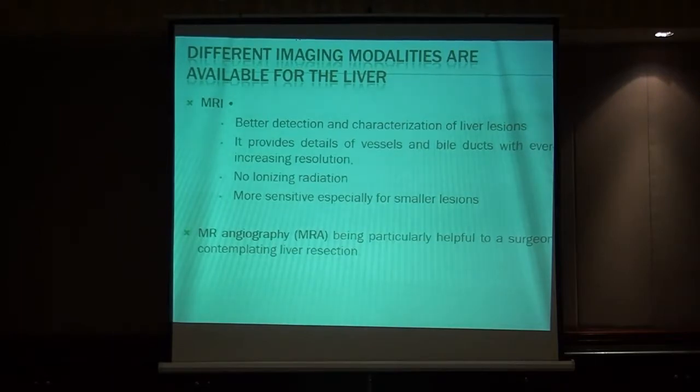MR has better detection and characterization of liver lesions. It provides details of vessels, bile ducts, and ever-increasing resolution. No ionizing radiation, more sensitive especially for smaller lesions. MRA is particularly helpful for surgeons contemplating liver resection.